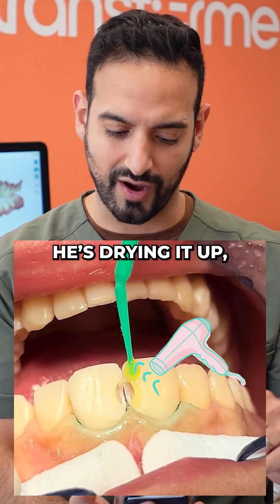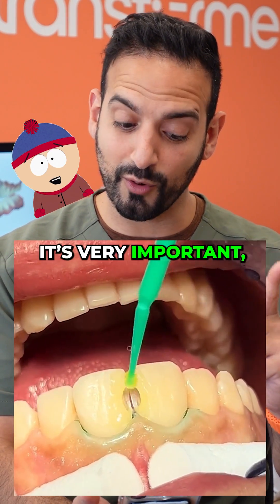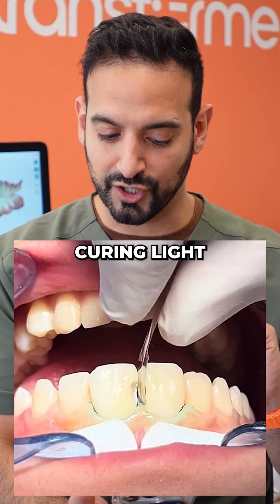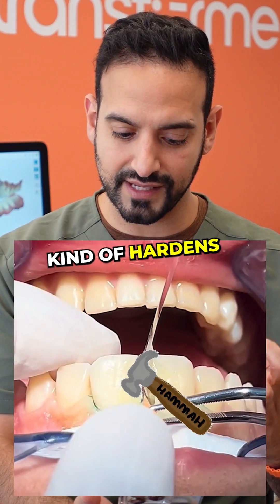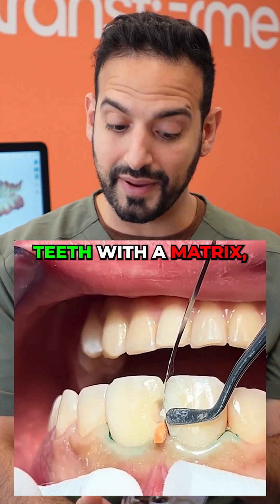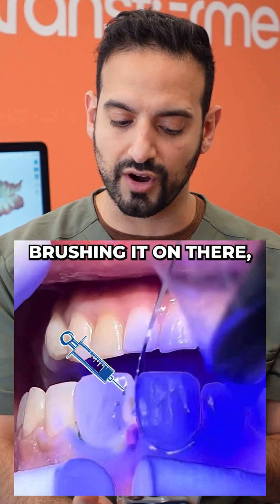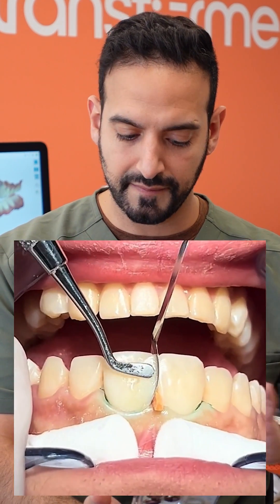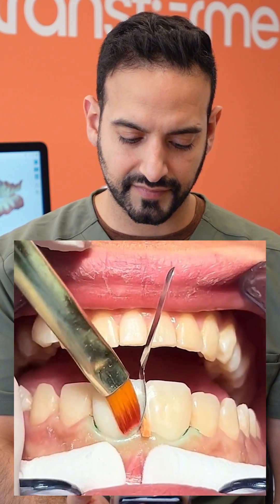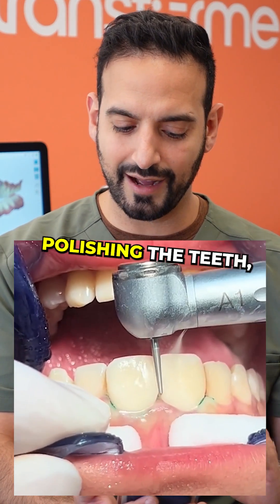Just drying it up and putting some glue — don't forget the glue, it's very important. That's a little stick. Drying it up, then putting a little curing light so that it hardens everything and gets it ready. Separating the teeth with the matrix — that metal thing — then putting in a wedge, and now putting in some composite filling, brushing it on there so you have a nice edge filling up the other tooth. Beautiful, looks good — even though he came in through the front, still looking good.